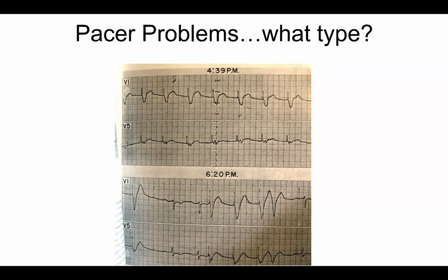It's not uncommon, and each one of you is going to be in the situation when you're on consult where you're going to get a call that some patient of ours who has a pacemaker needs to go to the operating room, let's say for an appendectomy or ENT surgery or something. And they'll ask the question, can we put a magnet on the device temporarily? Why did they want to put a magnet on the device? Does anybody know?